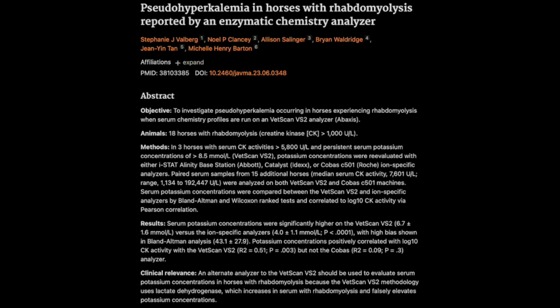And like you said before, that can have some serious consequences. Oh, absolutely. It can be stressful for the horse, and it can be expensive for the owner. The article really highlights the impact this had on the owners of those first three horses. They went through a lot of worry and expense, all because of this technical issue with the testing method. It really makes you think about how important it is to be aware of these kinds of things, and how easily things can get misinterpreted. Exactly.